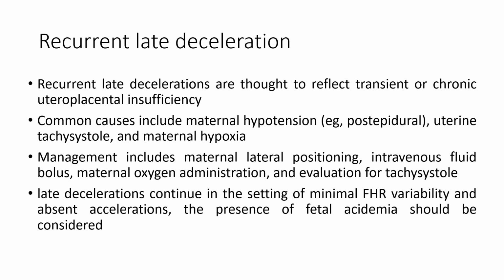The management is going to include lateral positioning to improve the venous return, intravenous fluid bolus in the case of hypotension, oxygen administration, and evaluation of the tachysystole. If it's oxytocin, then we should stop the oxytocin, give her more fluids to wash out the oxytocin. If there's late deceleration in the setting of minimal variability and absent acceleration, this means that acidemia should be considered.